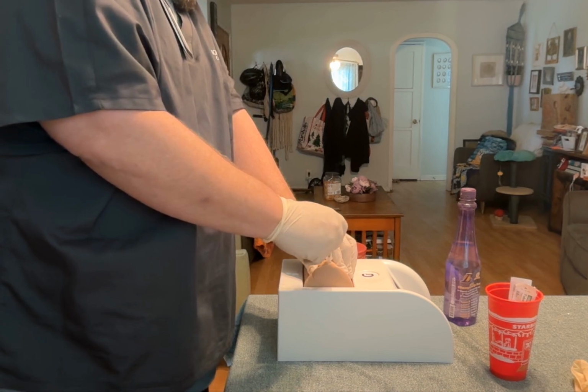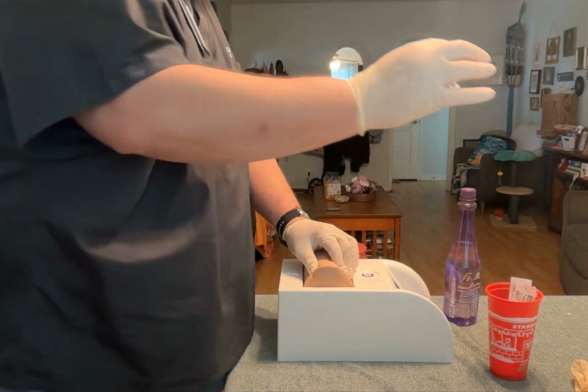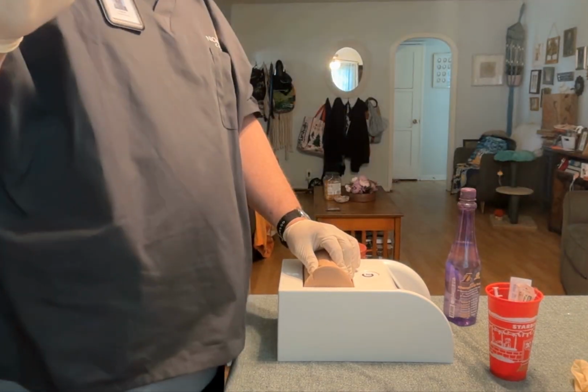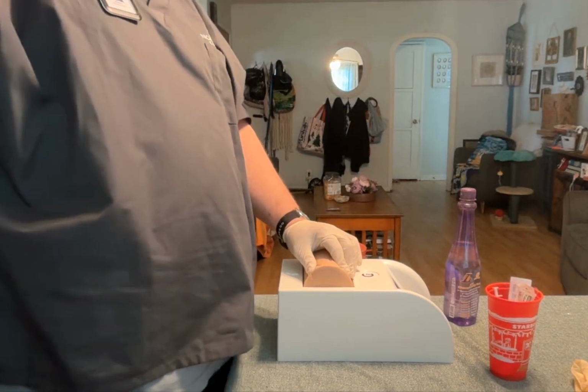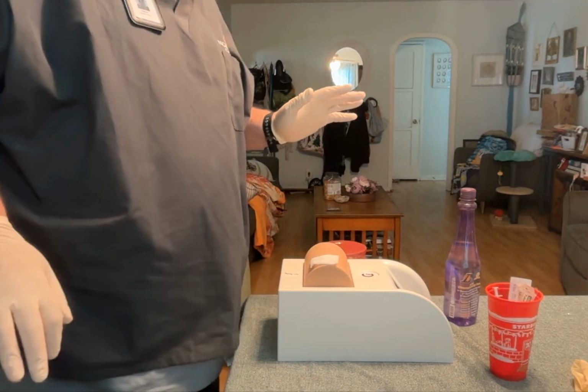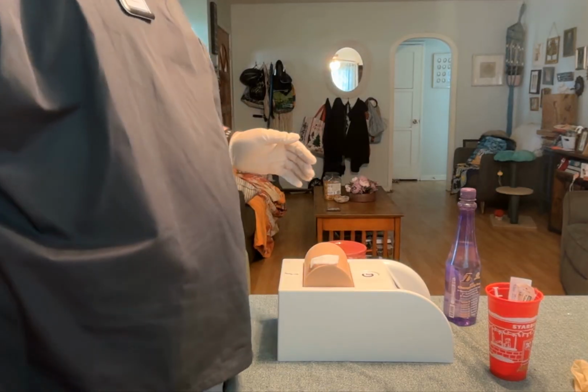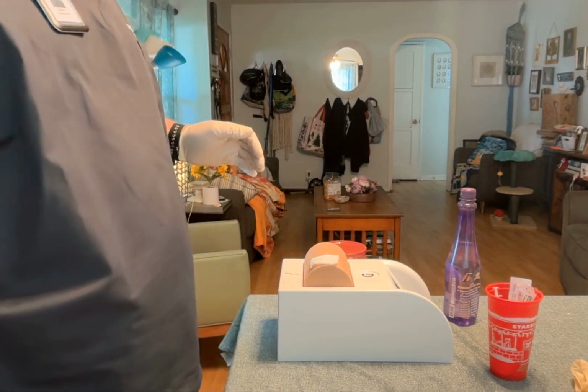Alright, that's 30 seconds. I'm going to pull my needle straight out. I'm going to put it in my sharps container. I'm going to let go of the skin. I'm going to put a piece of gauze on it. I'm going to see if there's any bleeding or any damage to the site. There's not actually. There's no bleeding. She looks like she came out pretty good.